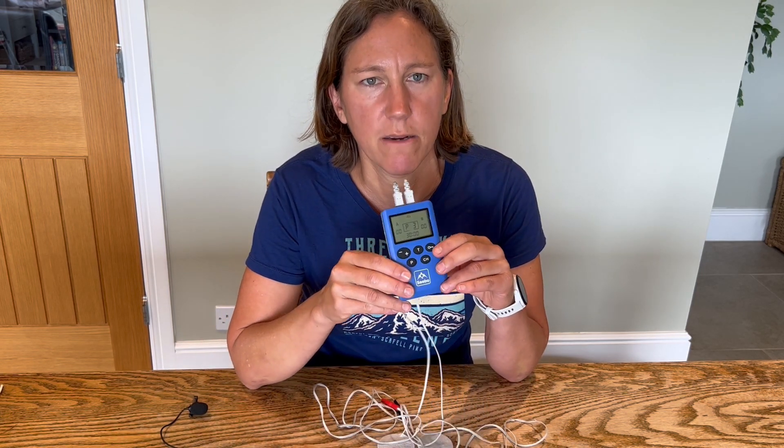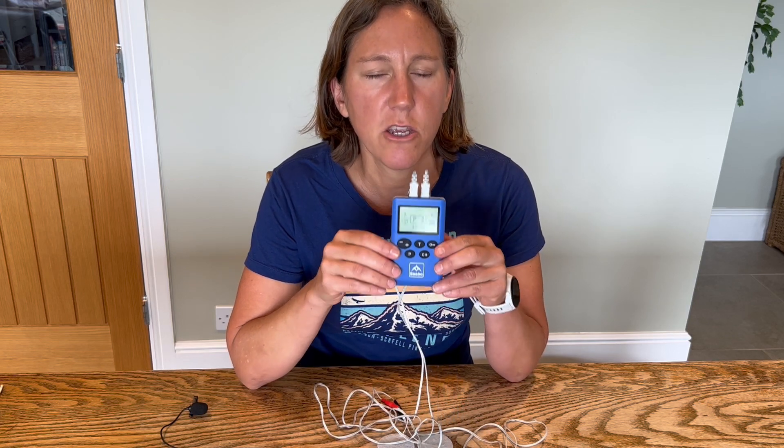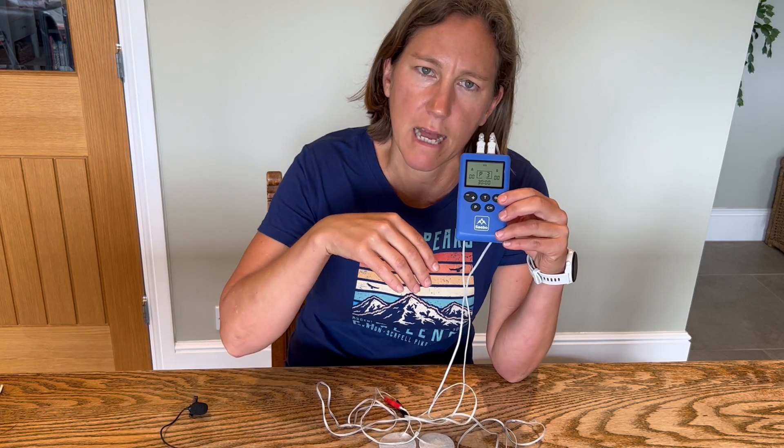The first top tip actually comes from a Sabo product user, somebody who's had a stroke. They're using the Sabo Stim Pro stimulation device to help build up strength in wrist and finger extensors. They also have a dropped foot, so they're using it to build strength in the muscle that lifts the foot.